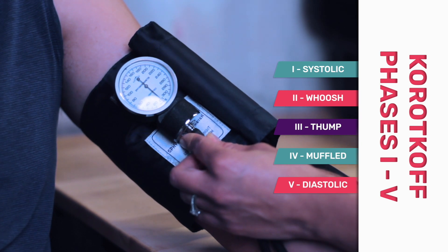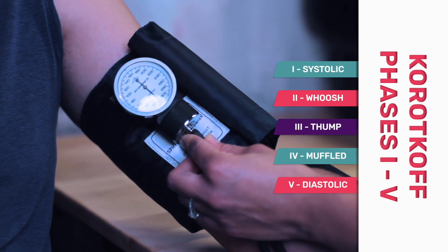So I would suggest that you use a headphone set so that way you can be able to hear everything, okay?